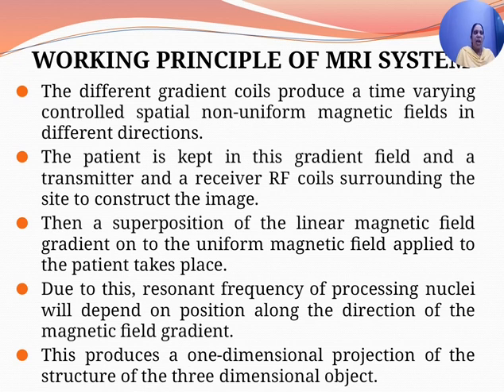What is actually happening here is that there is a horizontal tube that runs through the magnet and is called the bore. The MRI magnets we usually use have a magnetic field of 0.5 to 2 Tesla. The magnetic field is produced by passing current through multiple coils inside the magnet. Then we have the gradient coils.